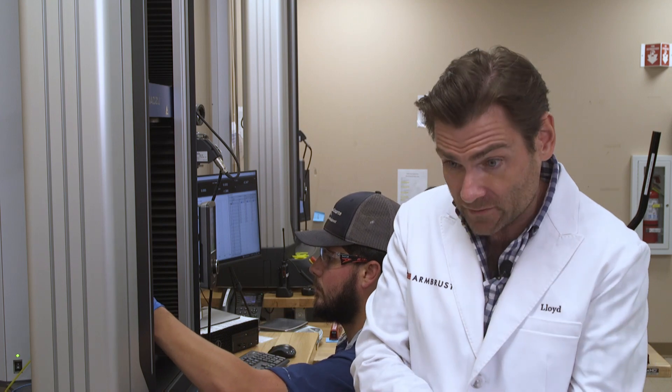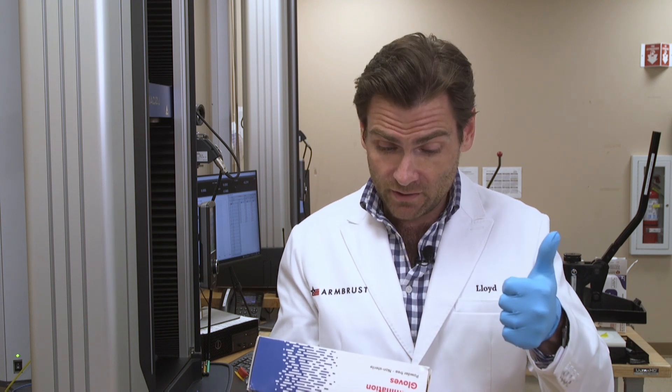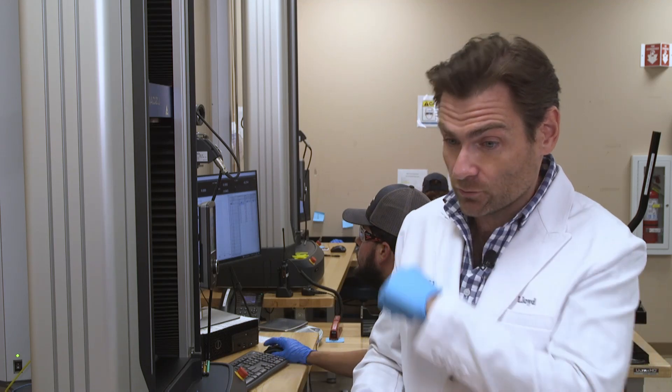One thing I'll point out on these boxes: it says 100 gloves by weight — they don't actually count the number of gloves, they weigh it. So you may get 95, you may get 130. It's just a more efficient way to do it. These are nitrile examination gloves, and they say they're 510K cleared and meet ASTM D6319, which is the ASTM standard for medical exam gloves. We shall see, because that's what this machine tests.